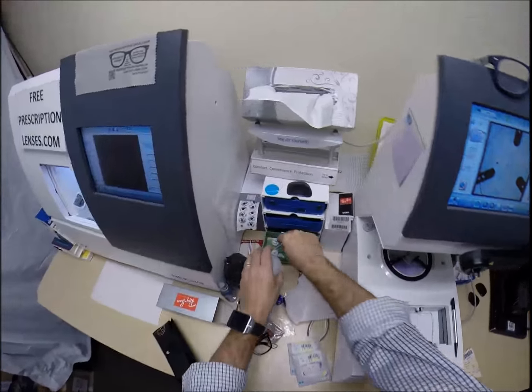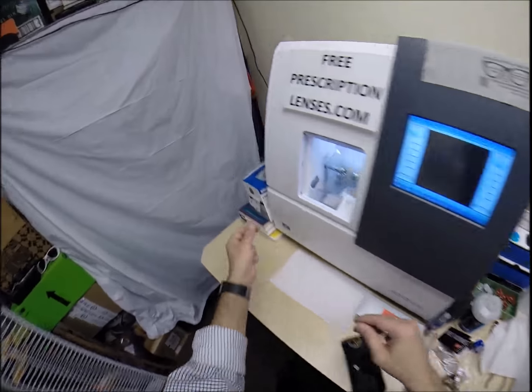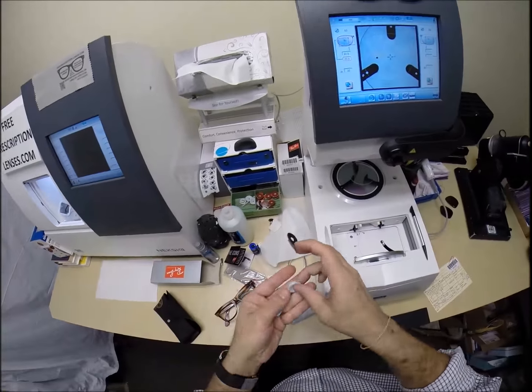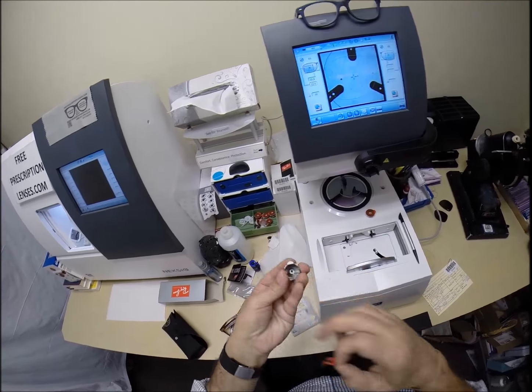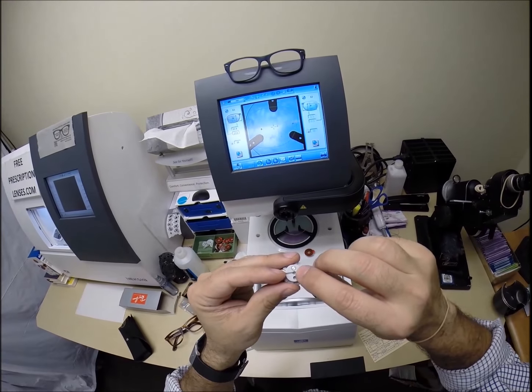So I need 2 blocks, or as I like to call them, Jenny from the block. I needed to get 2 double-sided adhesive stickers. The black side is the sticky side. I'm going to line up the first one. Do the same thing for the second one. Pull the paper away to make the black side sticky. Now on the back is a silver button that is a magnet. It's going to do its job twice tonight.